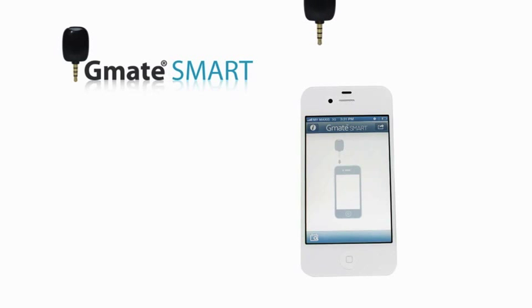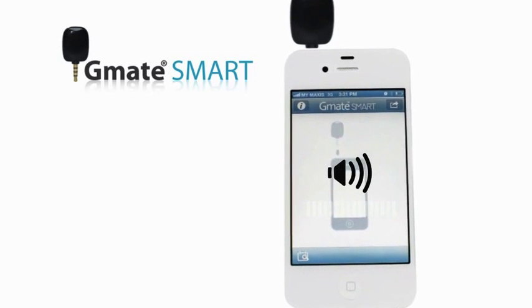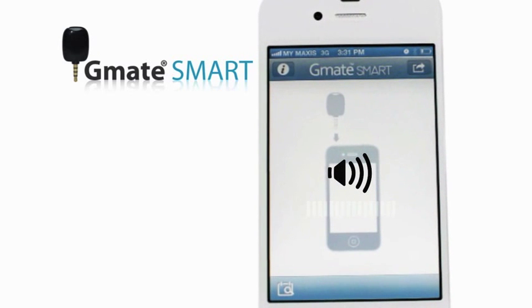Plug the G-Mate Smart Meter into your headphone jack. You may see a volume control dialog box appear on the screen. Make sure the headphone volume is turned all the way up so that the G-Mate Smart Meter has enough power.